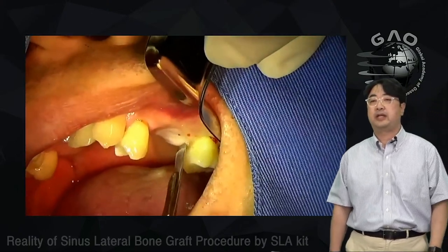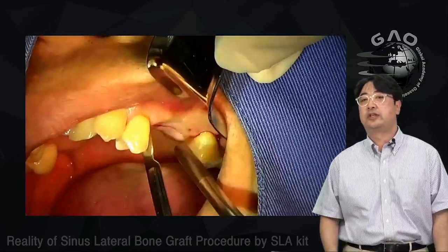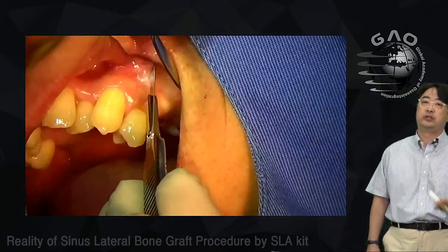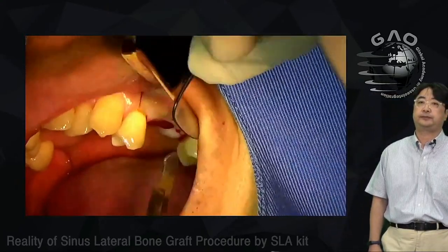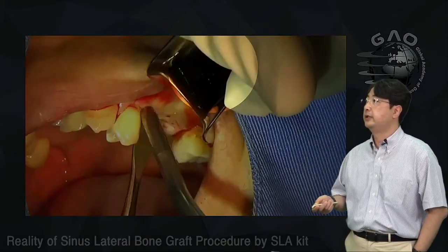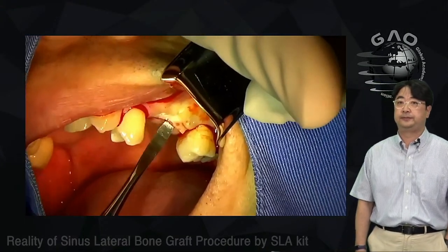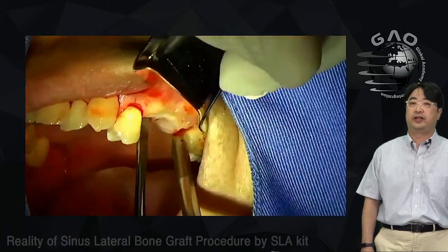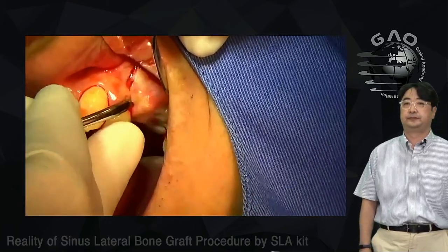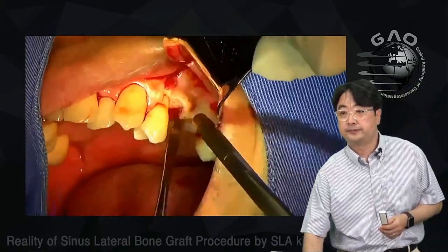I made the video a little faster. This is the movie clip while I'm making the incision. I made a crestal incision here, and I made one vertical incision on the front top, at number 24. I'm going to move a little faster.